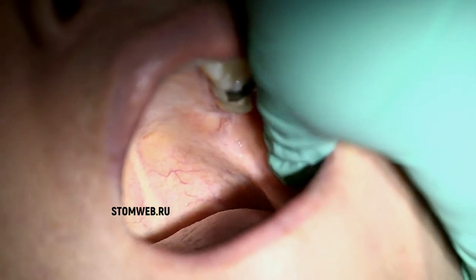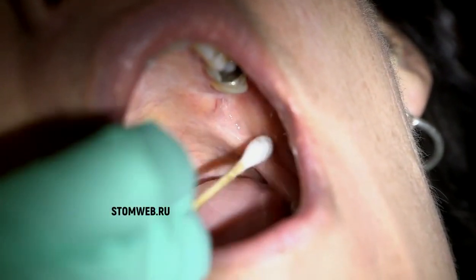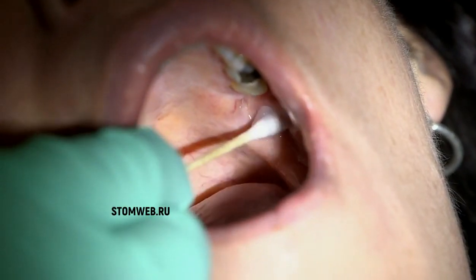Before administering the injection, we will apply topical anesthesia. Firstly, we will dry the tissues. Then we will apply topical for 1 to 2 minutes.